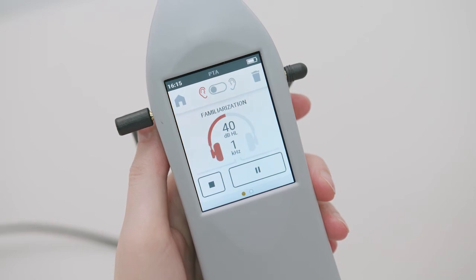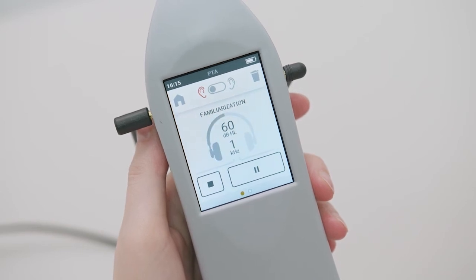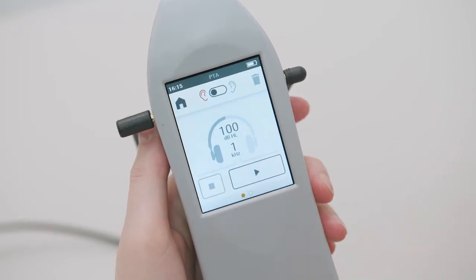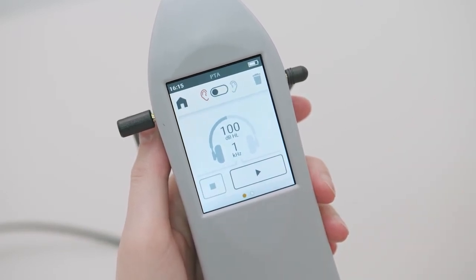The automatic examination includes an initial familiarization phase to train the patient how to do the threshold determination procedure, followed by the real test at all enabled frequencies. You can pause the examination by pressing the related icon or stop it by pressing the stop icon. The examination will end automatically when all the frequencies enabled have been tested on both ears.